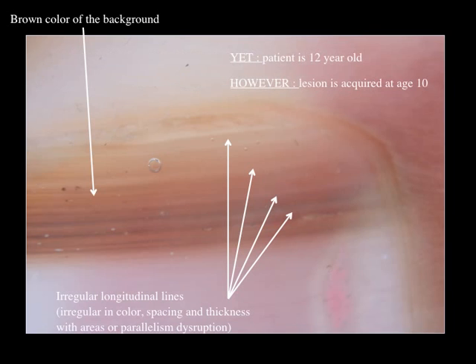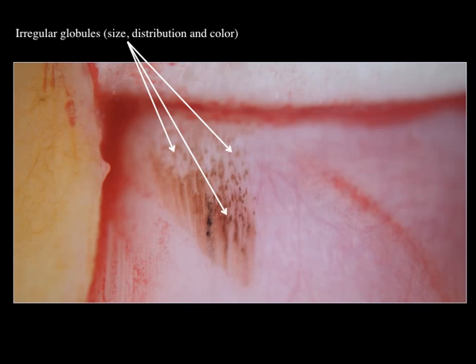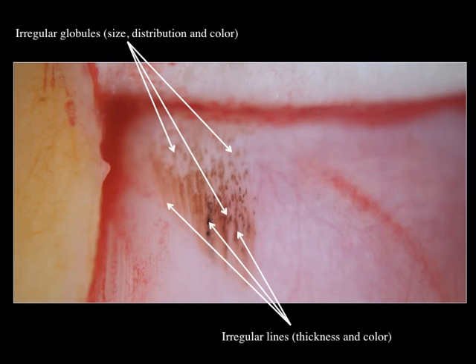Because the lesion is acquired, we decided to perform a surgical exploration of the nail matrix. This is non-contact polarized light dermoscopy of the nail matrix. The pattern shows irregular dots and lines with irregular globules — irregular in size, distribution, and color, with darker and lighter globules. The lines are also very irregular in thickness, color, and spacing.